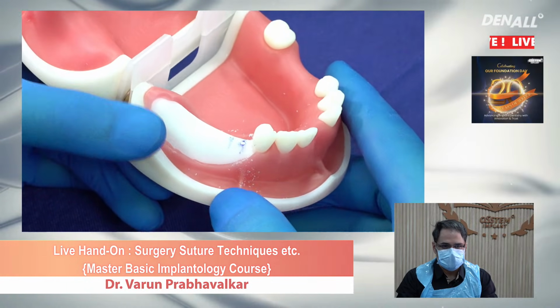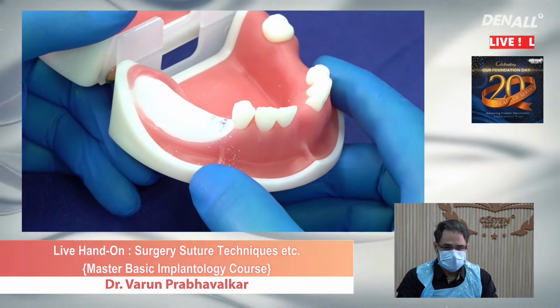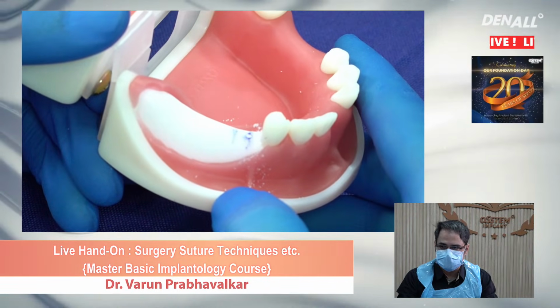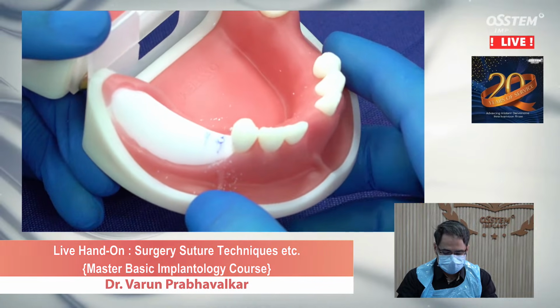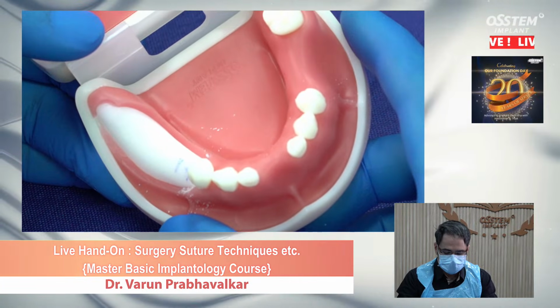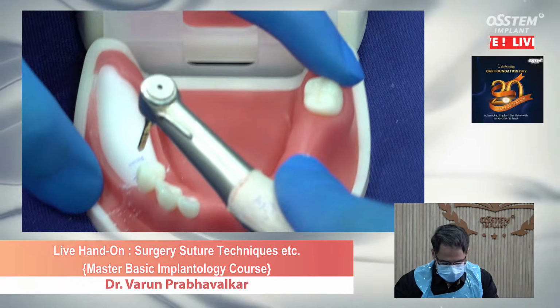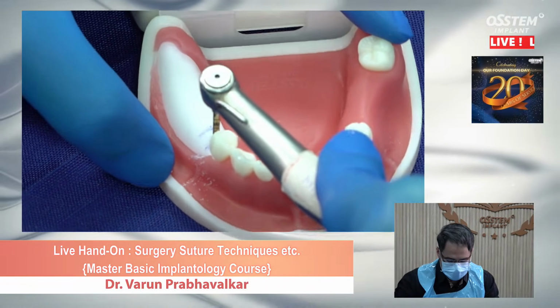Okay, at the crown level osteotomy, crown level angulation, we are going to check with the paralleling pin later. But over here, we are checking first for our osteotomy site on the bone level. Okay, I'm happy and satisfied with this, and I'm going to proceed further.